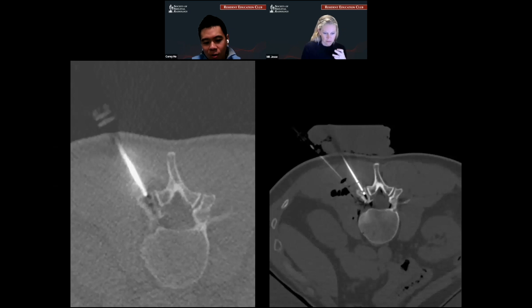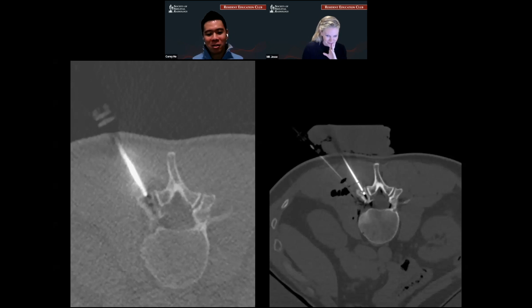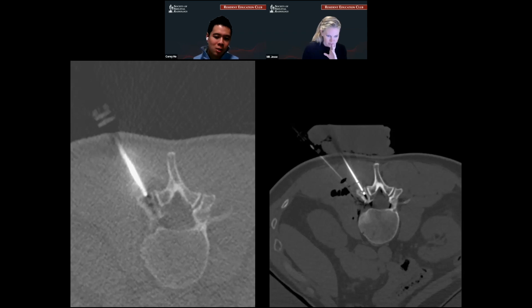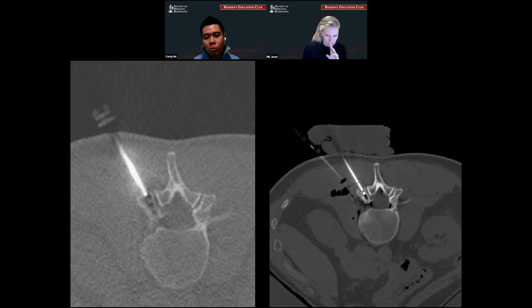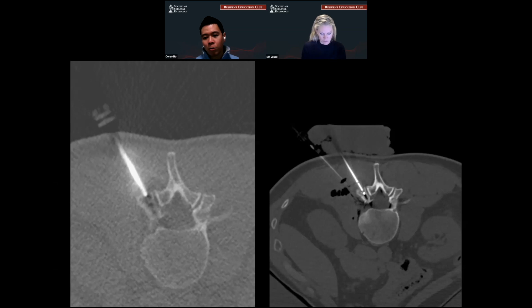Since we've already played with fire in this lecture, I decided we should play with ice. We used ice to treat this lesion — this is called cryoablation. You have to treat the cryoablation probe like it's made of glass, and I'll explain why later. Since you can't stick the probe directly into bone, my colleague drilled in with a powered bone biopsy device to take a core out of the bone to create a little area for the cryoprobe to be placed in. It may sound complicated, but actually because we're using imaging, it's really easy to find that hole again.